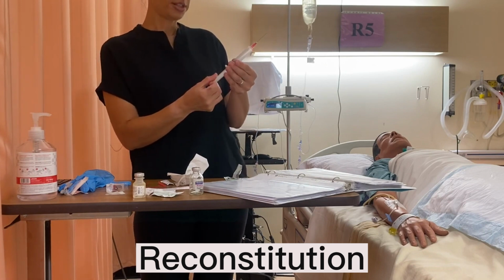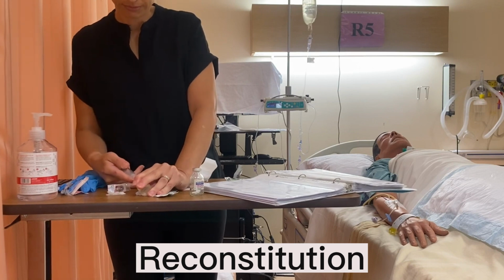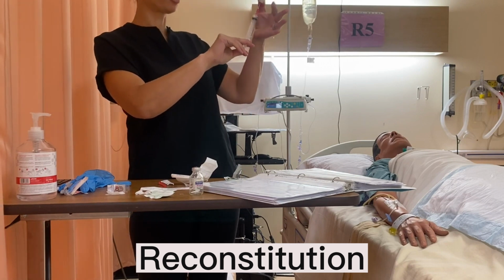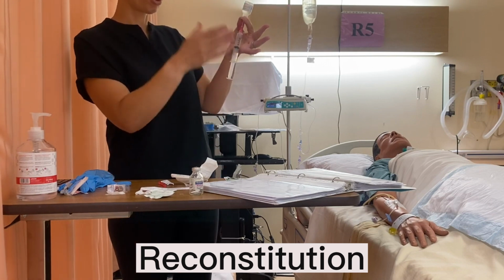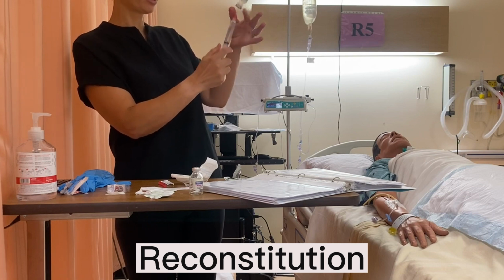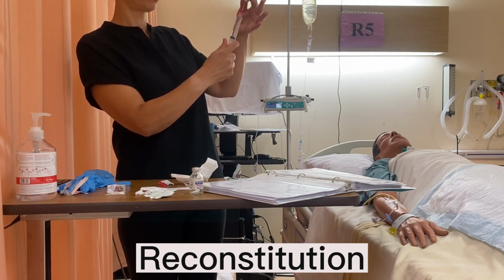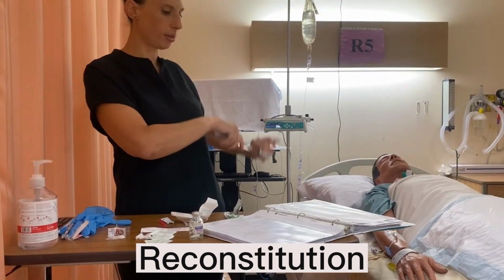And I'm going to instill 10 mLs of air. Okay, if you get too much pressure, don't push it because the top can fly off. Just stop pushing in the air and then allow it to fill. So it's going to equalize the pressure. It's going to pull back on that sterile water. You can keep pulling back and then you can add a bit more air. Draw maybe just a little more than 10 mLs.